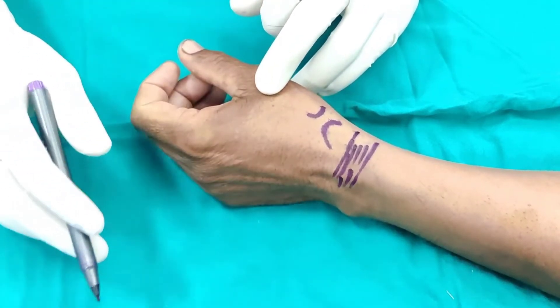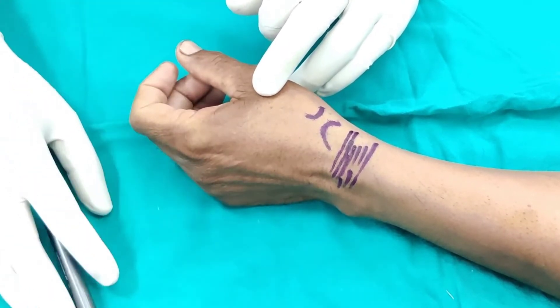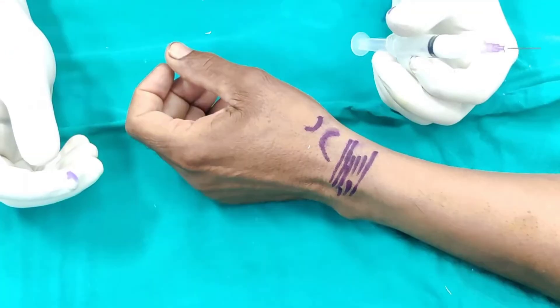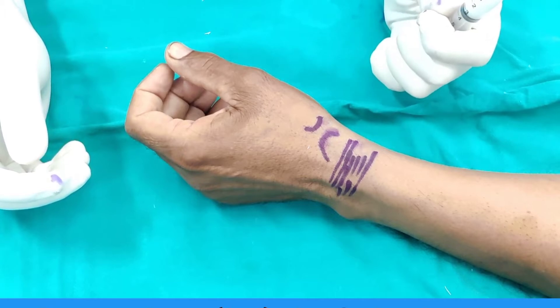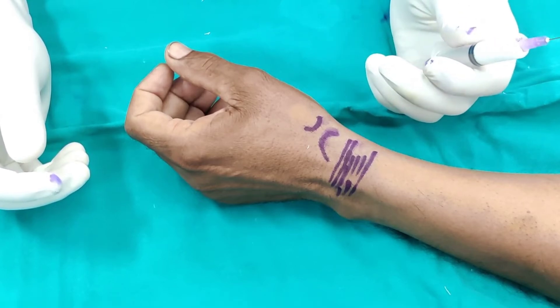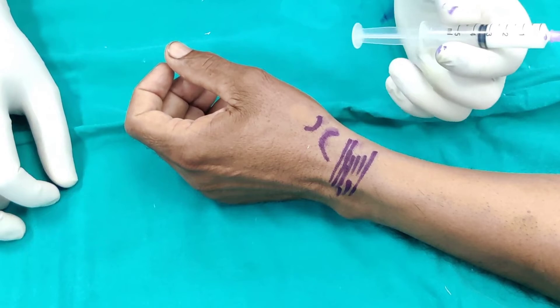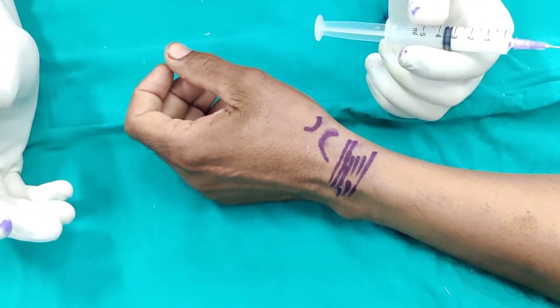Our aim is that we will be injecting just into the synovial sheath of the first compartment. I have taken 40 milligrams of depomedrone with 2 mils of 1% lignocaine. If you are doing it under ultrasound guidance, you can probably use less volume. Because we are doing it blind, I would like it to spread so that it covers the area of interest.